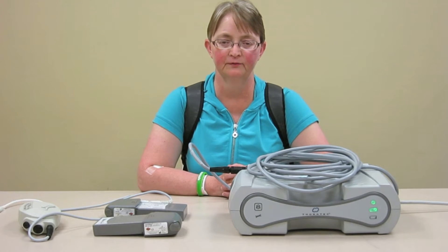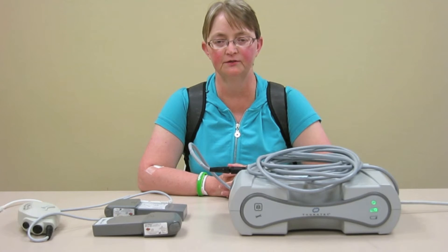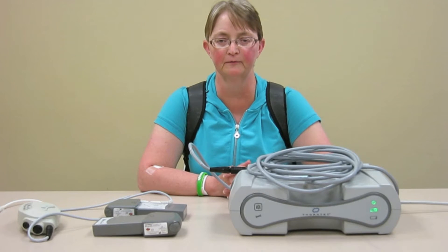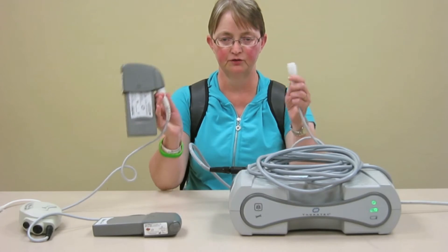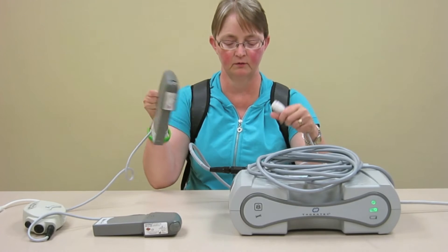If you're going to have a nap in the afternoon or when you go to bed at night, you need to disconnect the batteries and plug into the AC power module so that you can nap or sleep for as long as you need to. Again, it's an easy process. Make sure you've got the white cord with the white cord.